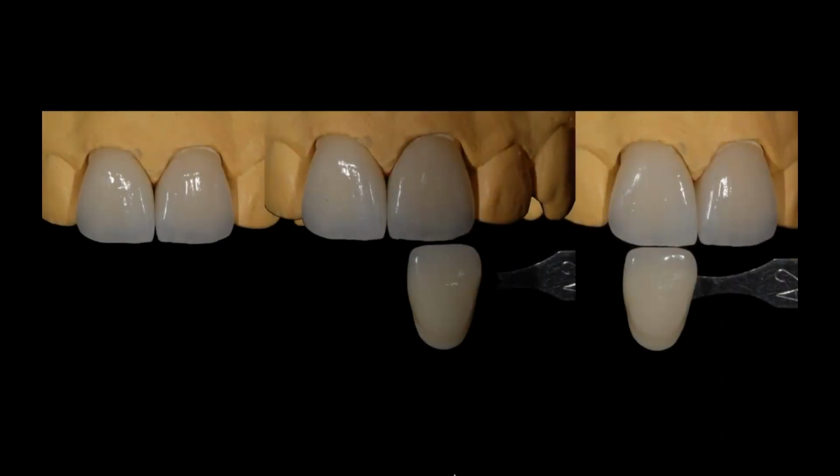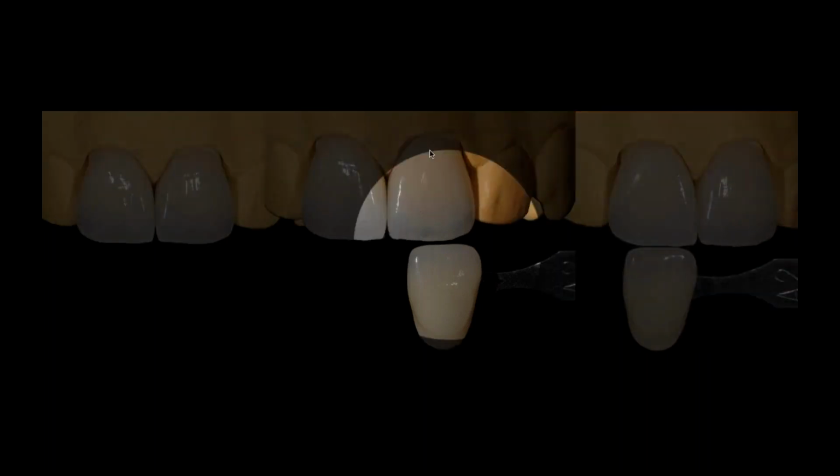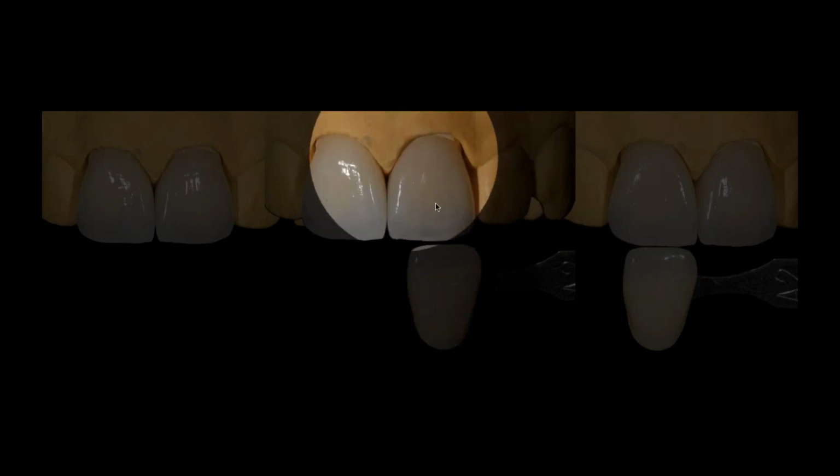Now watch if I put a shade tab next to these. This is an A2 shade guide. What do you notice about the value on my A1 buildup? It almost looks lower value than the A2. Look at the value there.